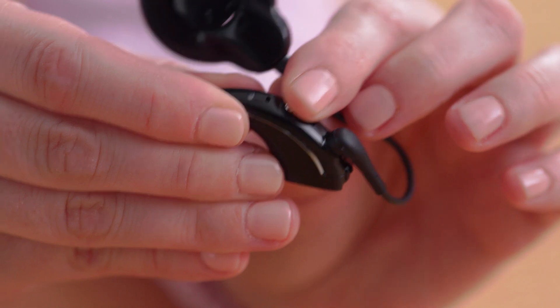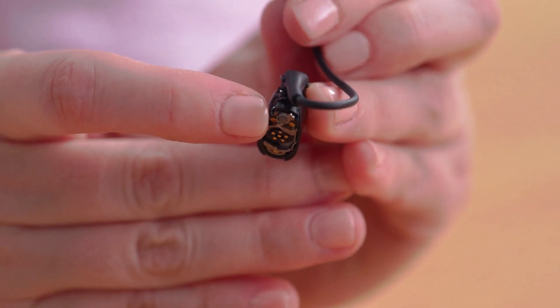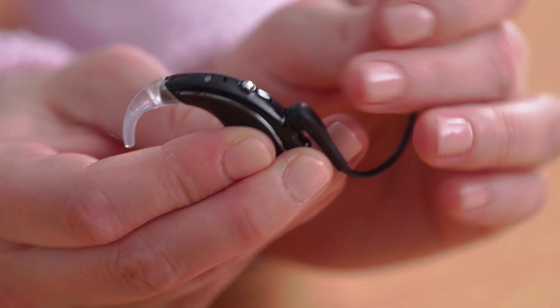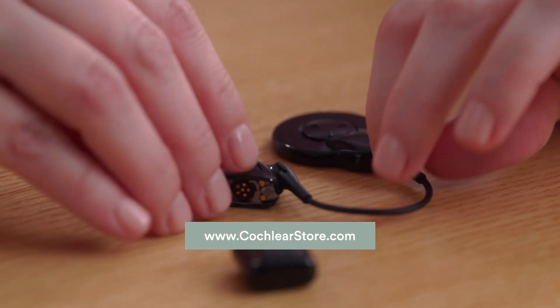There is also a tamper-resistant battery lock, mostly used for pediatric recipients. The processor has two microphone ports, as well as an indicator light. The microphone protector needs to be replaced every three months in order to optimize sound quality. You'll have extra microphone protectors in your kit and can order more from the online Cochlear store.